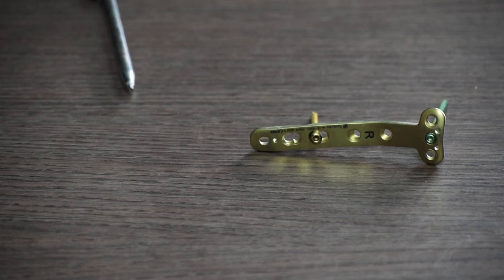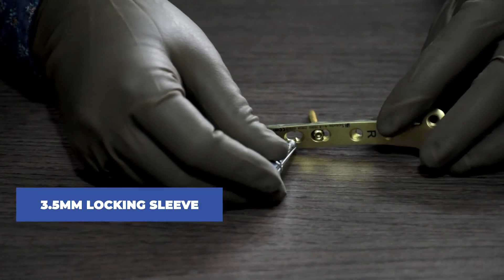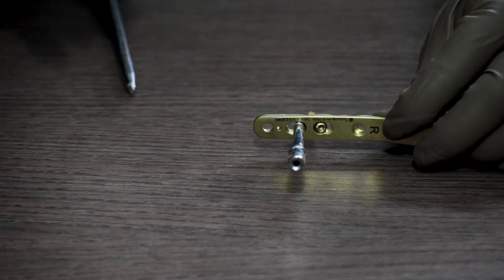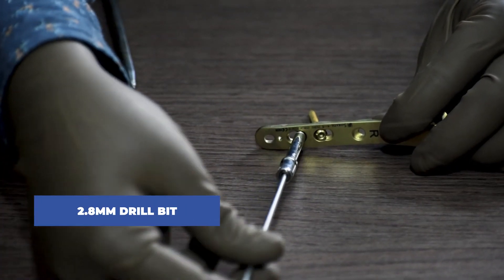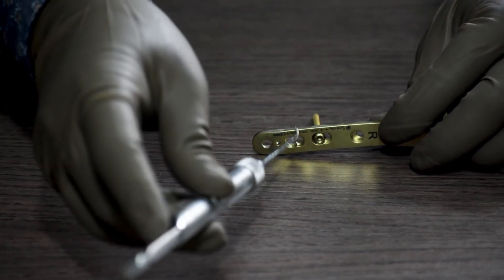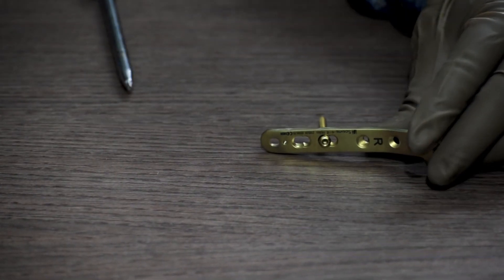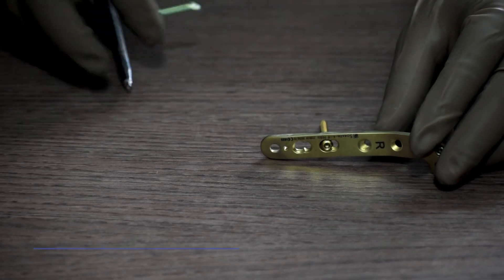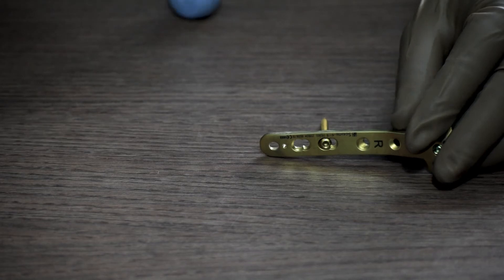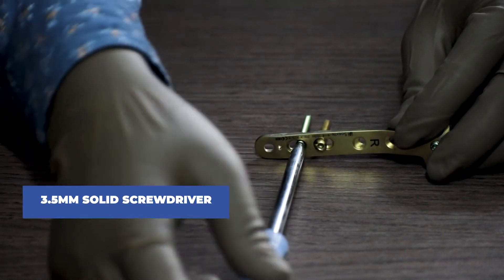After this, we fix the shaft end of the plate with a locking screw. We again take a 3.5mm locking sleeve, then use a 2.8mm drill bit to drill through it. We then use a depth gauge to take the measurement. We take a 3.5mm locking cortical screw of the measured length and, with a 3.5mm solid screwdriver, lock the screw in the plate on the bone.